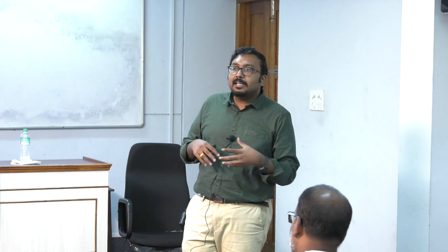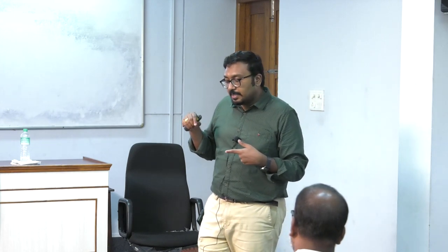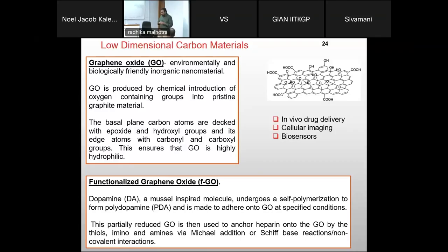Heparin is an anticoagulant that is used. Like we discussed before, continuous anticoagulation is required when hemodialysis is run. Heparin today is the most commonly used anticoagulant, except for some patients who developed allergic reactions to it. So we tried to immobilize heparin onto the graphene oxide sheets, again using a biopolymer or biolinker, which is your polydopamine. So the chemistry part, I hope everyone knows that, yeah.